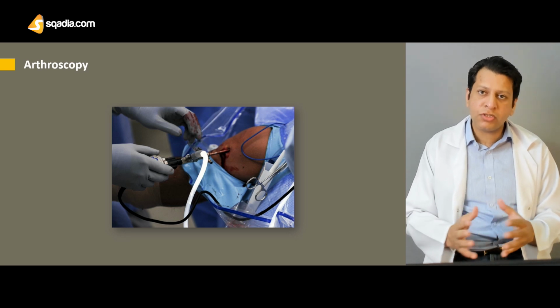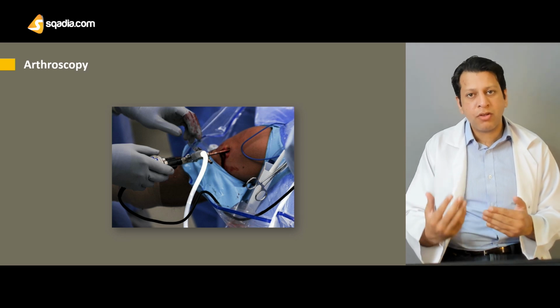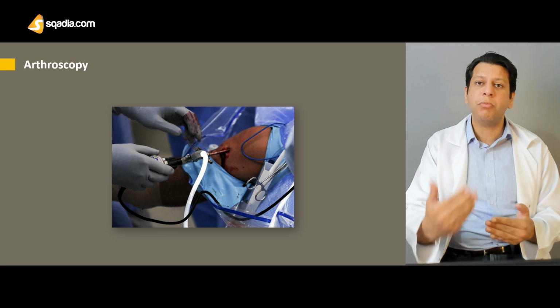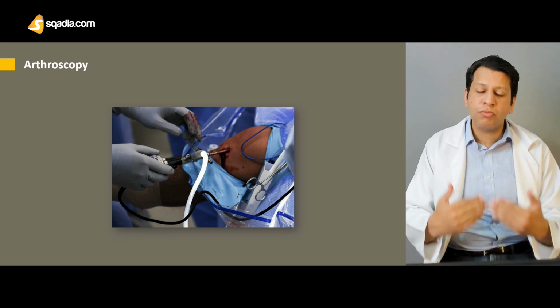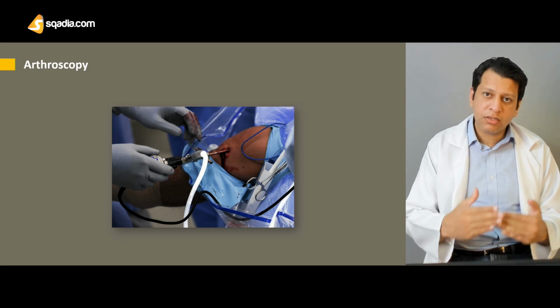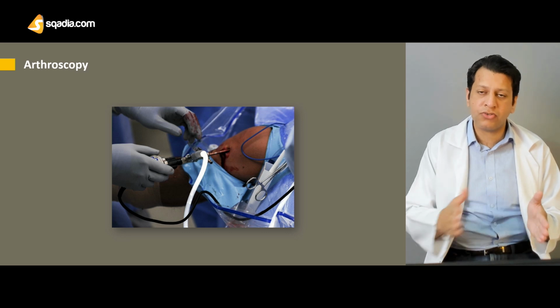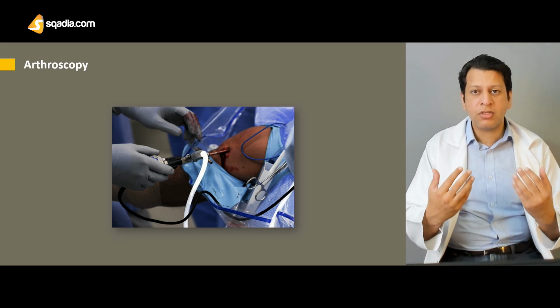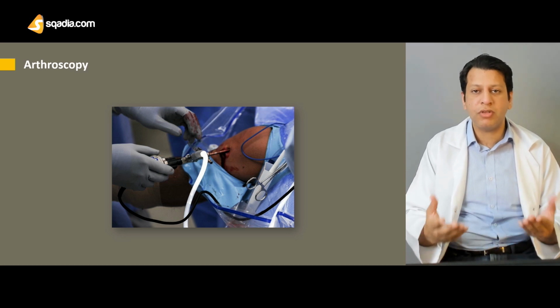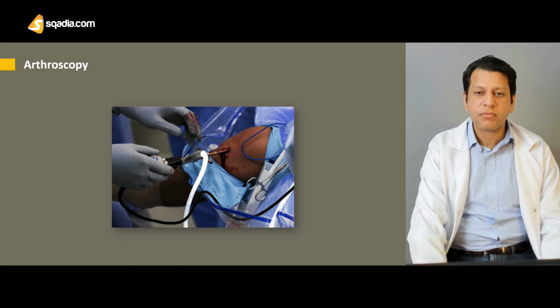Initially there was a single lens system, and the normal light source was used. Then they started using a light bulb source as well. From that onward, multiple lens systems evolved. From then onwards, the graded index refraction system evolved. So things have evolved over almost 100 years of history to the kind of thing we see today in modern day arthroscopes, especially when you can view it in the case of shoulder and knee arthroscopy.